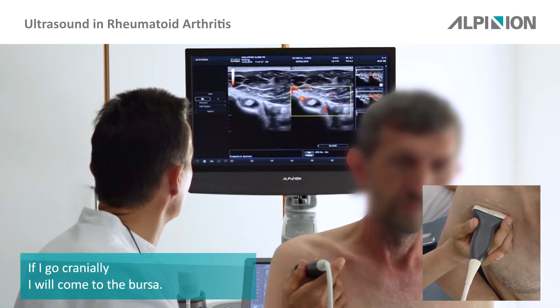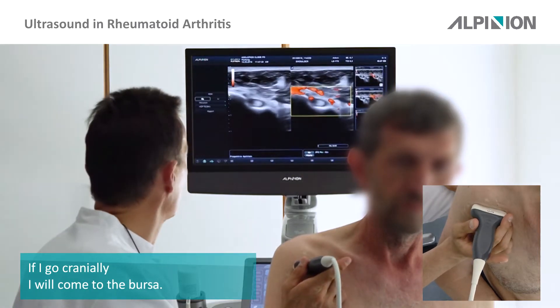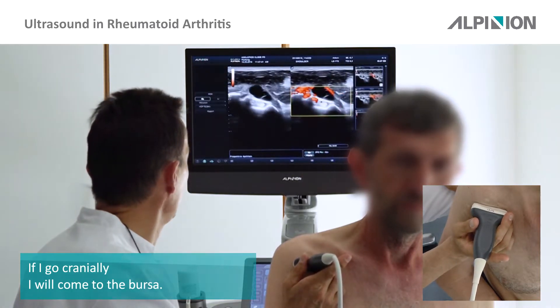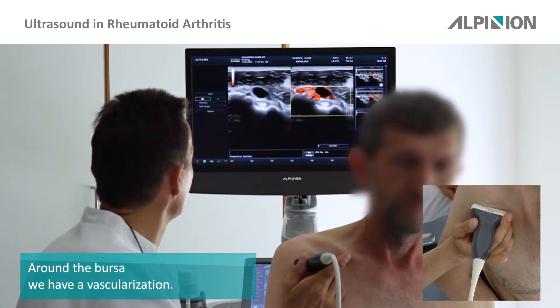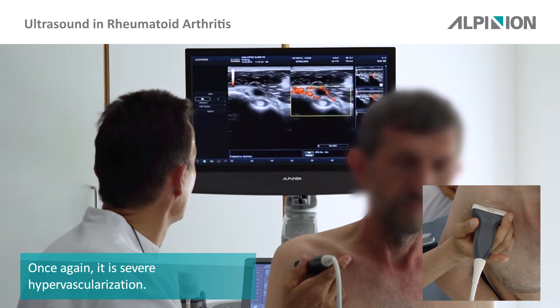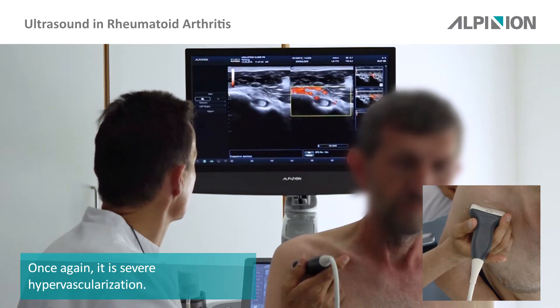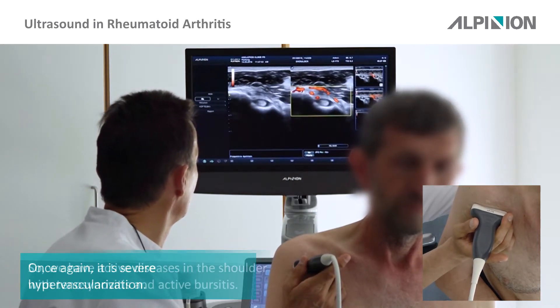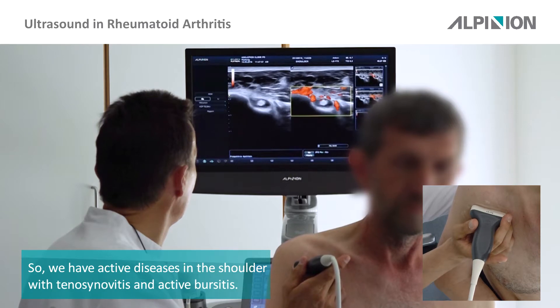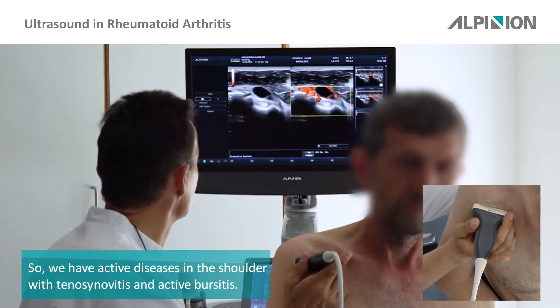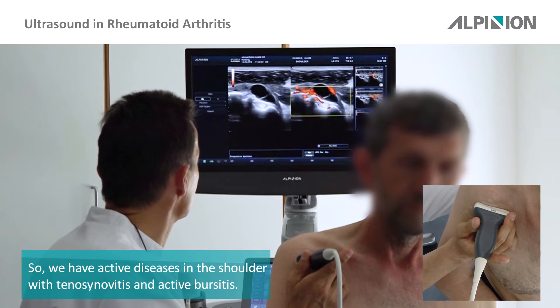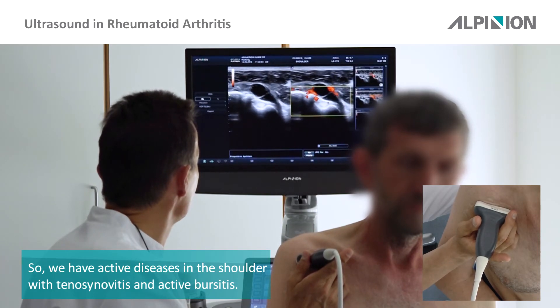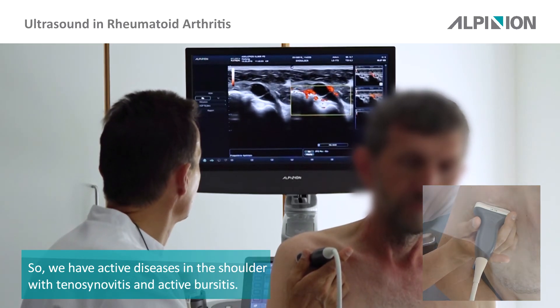If I go cranially I come to the bursa, and around the bursa we have vascularization — once again severe hypervascularization. So we have active disease in the shoulder with tenosynovitis and bursitis, active bursitis.